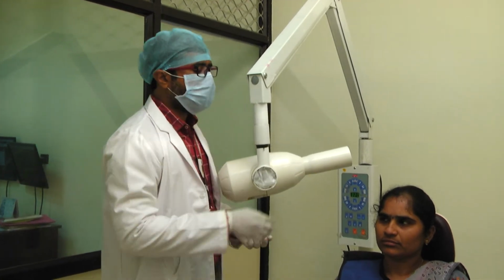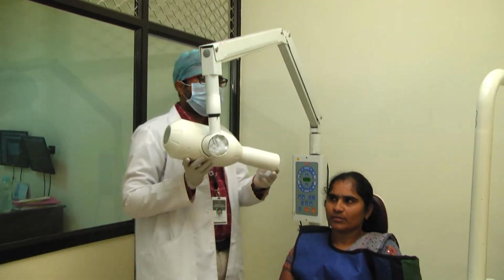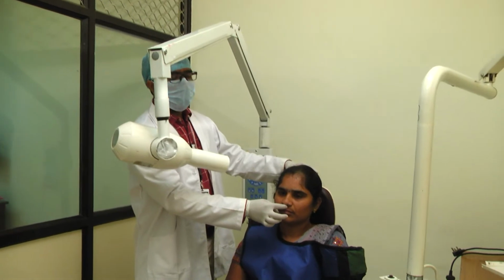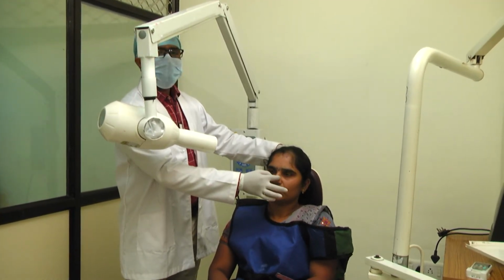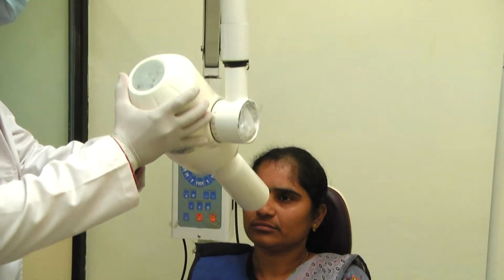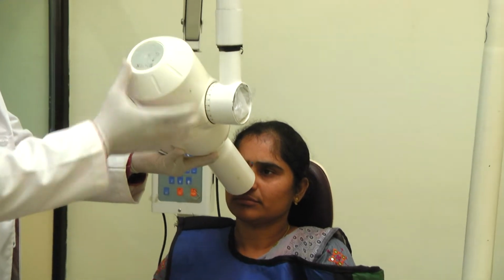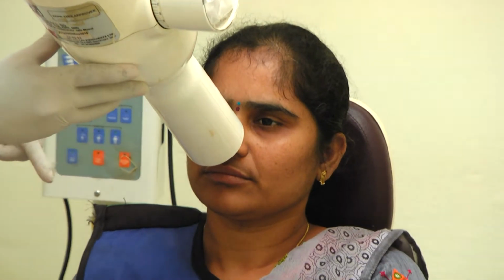After the placement of the film is done, for the maxillary incisor, the point of entry of the central X-ray beam is through the upper lip, exactly in the midline, just below the septum of the nostril. So that is the point of entry through the upper lip, exactly in the midline. This is how the point of entry has to be for maxillary central incisors.